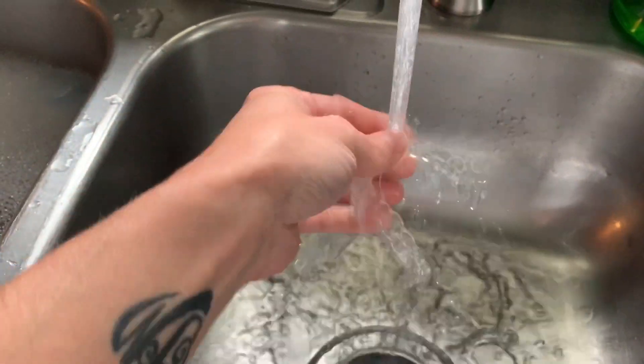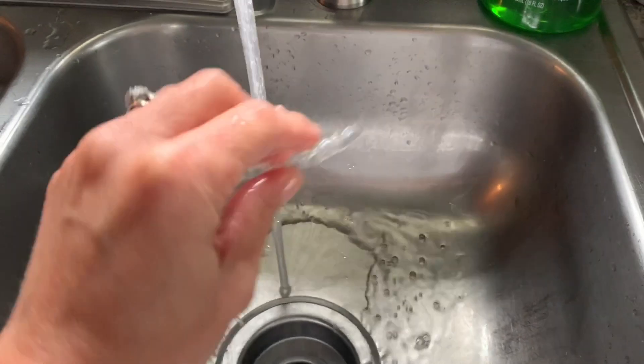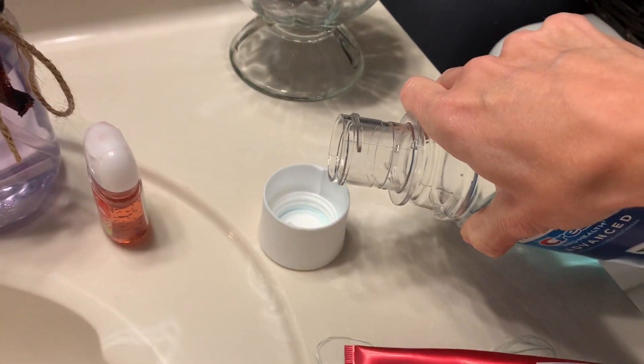I also clean my cases out with antibacterial soap, which helps kill the germs and bacteria that can build up in them as well.